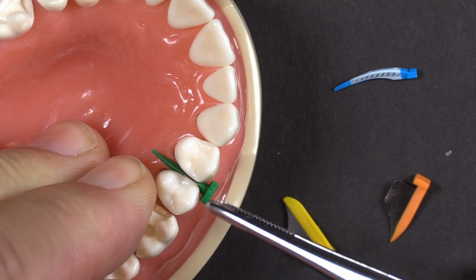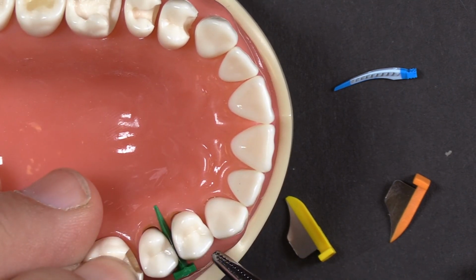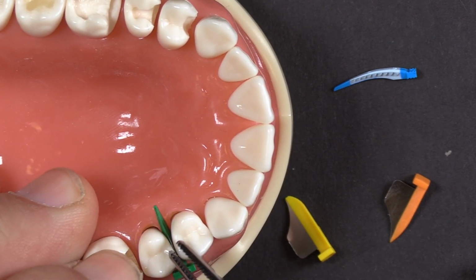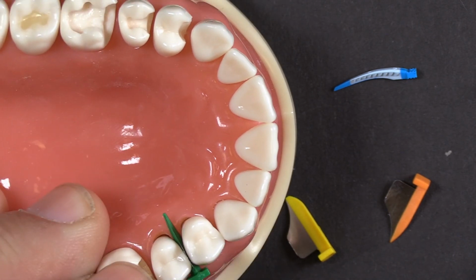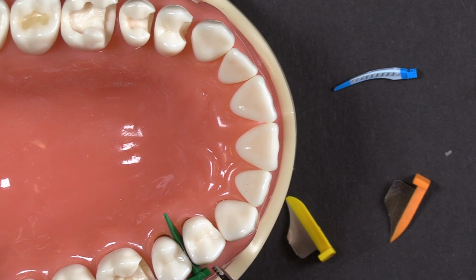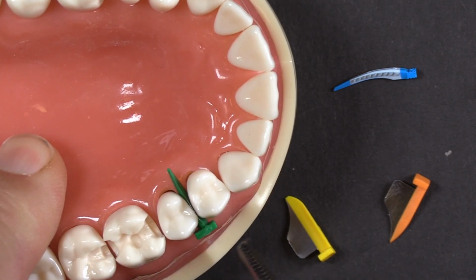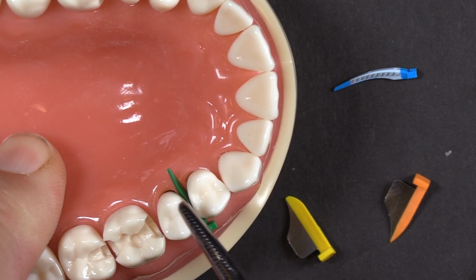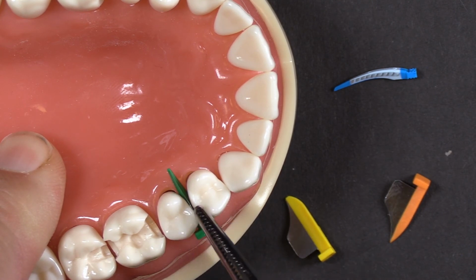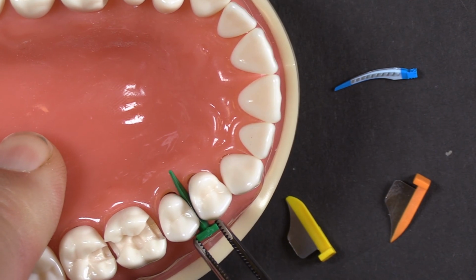down by the gingiva. It should be quite firm to insert. And that way the wedge is driving the teeth apart and not the blade. And that's if you're using a fender wedge for like a crown prep or a larger class 2, that's extremely important because you want the wedge to be what's holding it in place, because when you break the contact on a crown prep or a larger class 2 and the blade is all that's holding it in place, if you hit the blade with your burr, you could dislodge the fender wedge. So by having the wedge part firmly engaged, it's going to hold in place.